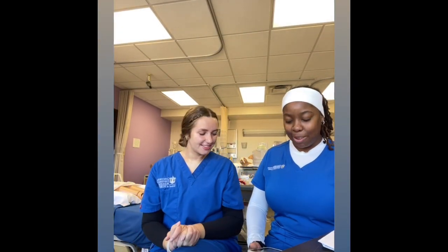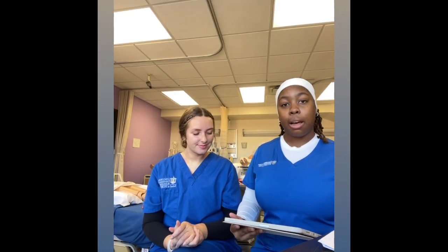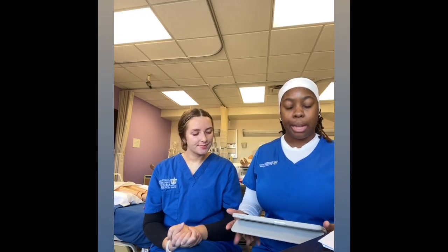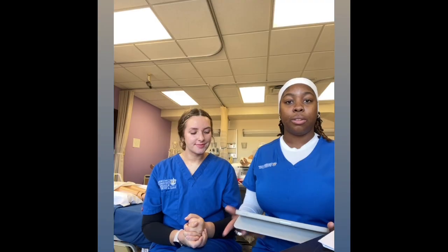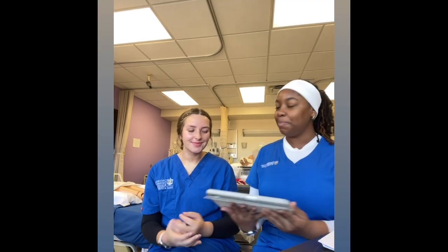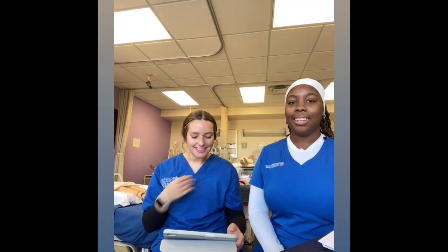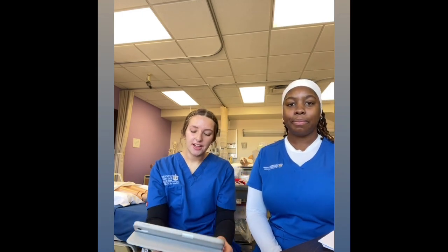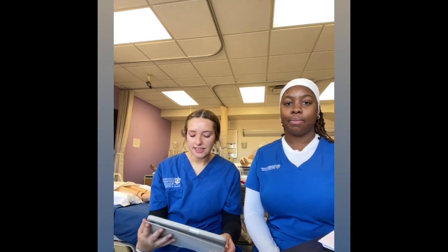So in conclusion, today we reviewed what subcutaneous injections are and when they should be used, steps of preparing and mixing both NPH and regular insulin, how to choose and assess the appropriate sites that we went over earlier, and then overall the importance of patient education, safety, and following those 6 rights of medication administration. As nurses, it's our responsibility to ensure accuracy, safety, and patient comfort during every injection. We always want to communicate clearly, use aseptic technique, and teach our patients how to properly manage their own injections when needed.